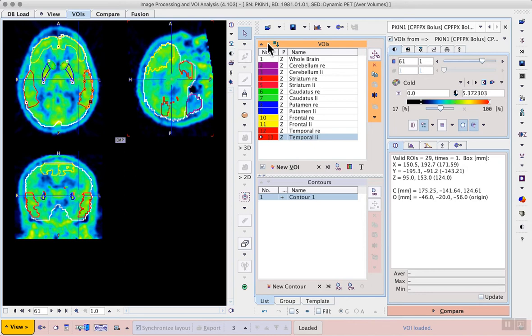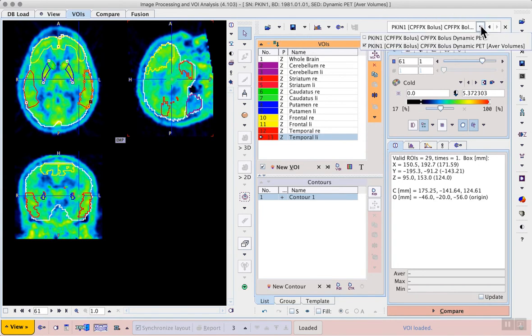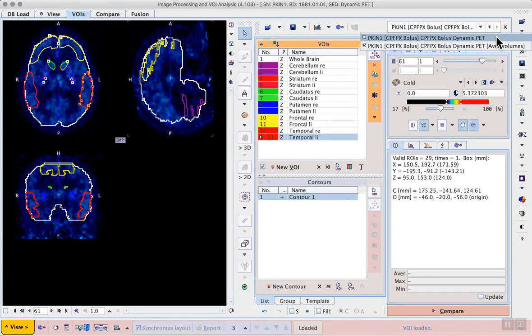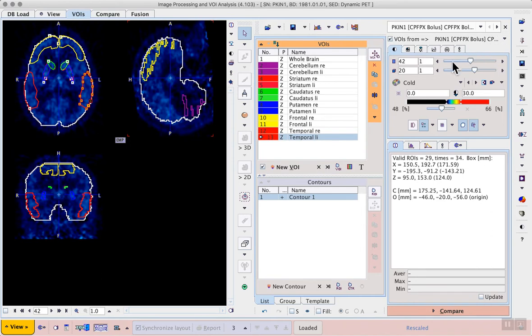Then we can calculate the time activity curves using the kinetic modeling button to the right of the selected statistics configuration.